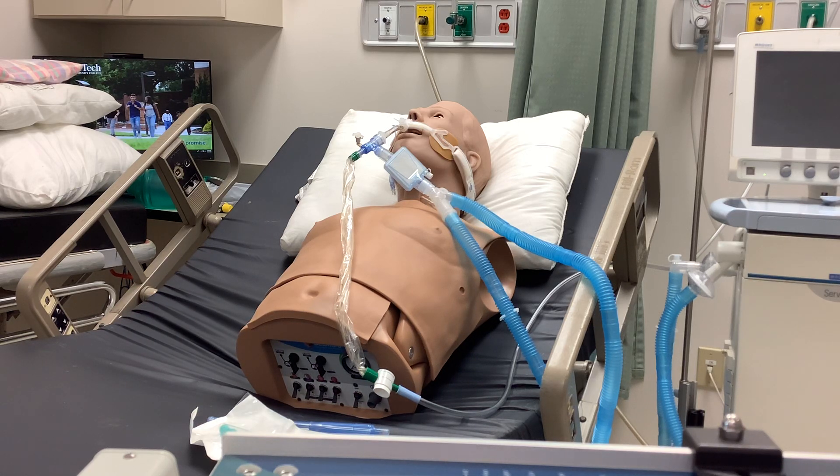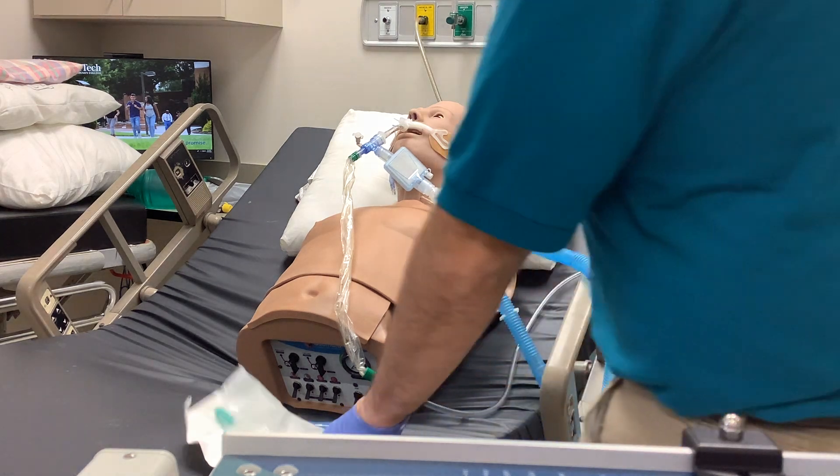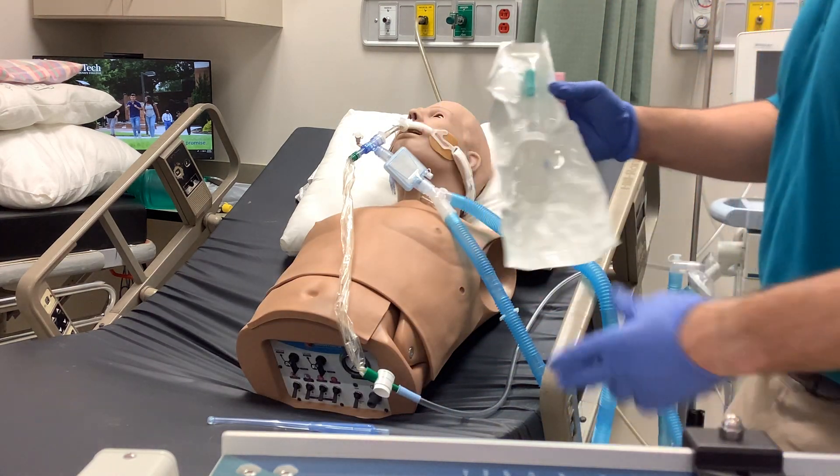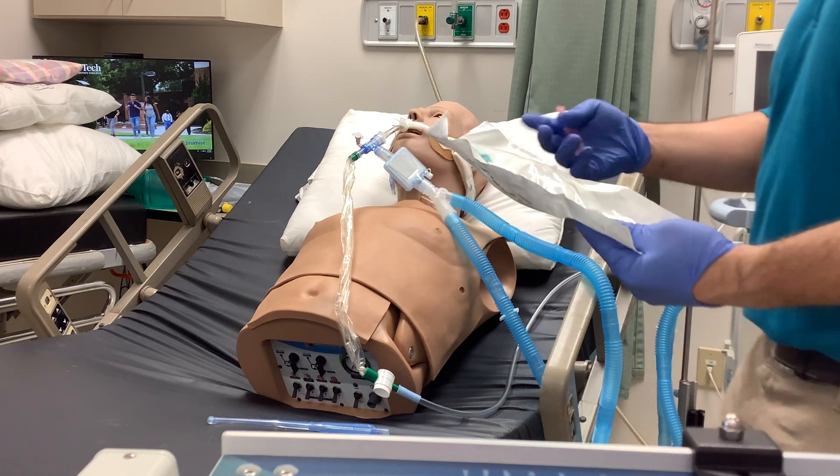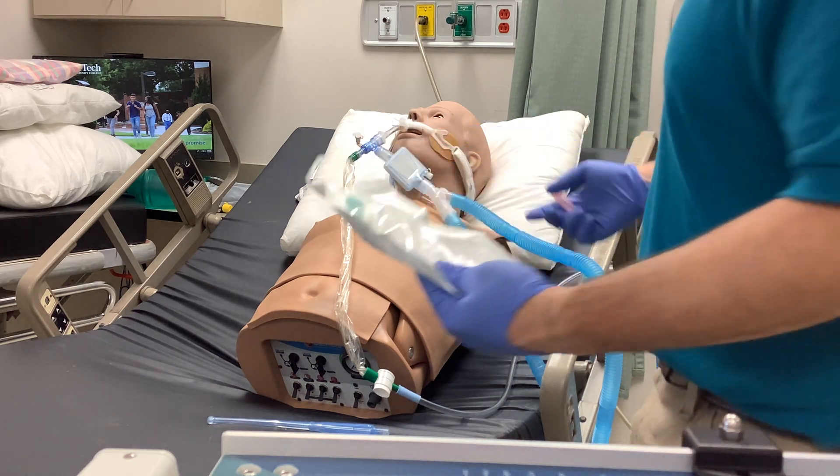Now let's say you've been tasked with getting a sputum sample from somebody. One of the things that you're going to utilize is a Lukens trap in order to be able to do that. This comes in a sterile package and you want to make sure that it maintains sterility while you're utilizing it.